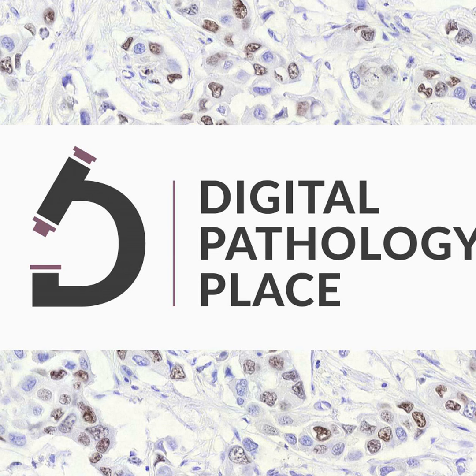But this CONCH is a visual language model, a visual language foundation model developed using diverse source of histopathology images. Keyword diverse source. We're going to talk about it in a second. Biomedical text, and notably 1.17 million image caption pairs. Amazing. It's a little less than 5 million, but it's already in million. It's not like hundreds, thousands, it's millions. That is a lot.